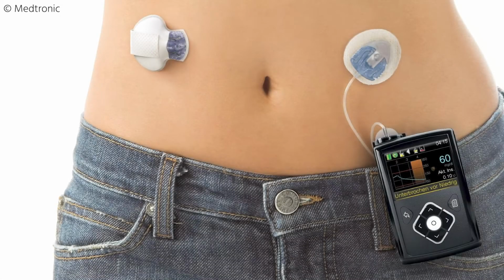For our listeners who may not have seen a pump, a pump is a small device, generally with a battery, and it will be filled with a certain amount of insulin that the patient will change, usually every 3 days. So it has about 3 days worth of insulin. Instead of taking multiple injections through the day, the patient has a pre-programmed level of basal insulin. You might have a patient who's on 20 units of Lantus, for example. Instead of giving 20 units of Lantus, it will give 0.8 units per hour over the 24 hours.